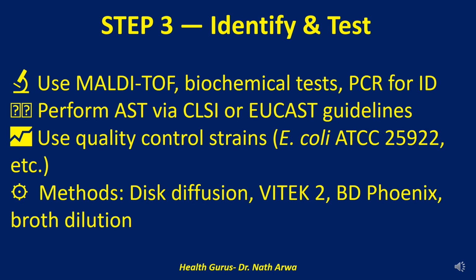Next, it's time for AST, antimicrobial susceptibility testing. But don't just wing it. Follow internationally accepted guidelines from either CLSI or EUCAST. These standards define which antibiotics to test, how to test them, and how to interpret the results, ensuring your data is reproducible, reliable, and respected worldwide.